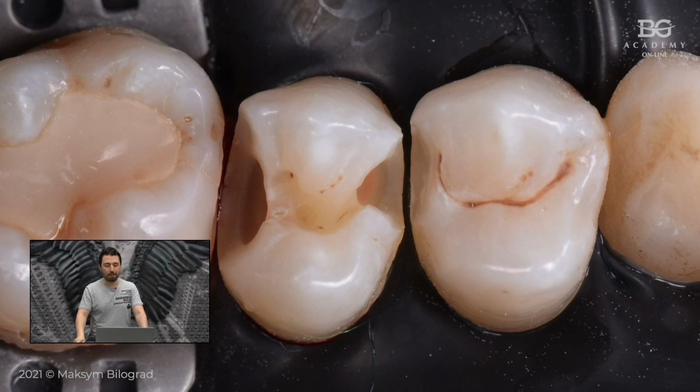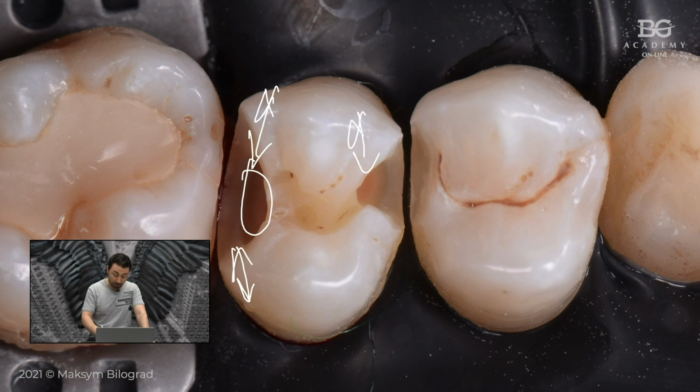Okay, so I'm showing you now what I actually did here. Considering the fact that the cavities are very small and surrounded by very thick walls, and there is no need to do anything from an occlusal point of view here. We're not changing the vertical dimension, for example. We just do aesthetic treatment here. So considering all these mentioned facts, I can say that there is a strong indication in this case to do a direct composite restoration, and it will be a very simple and fast approach.